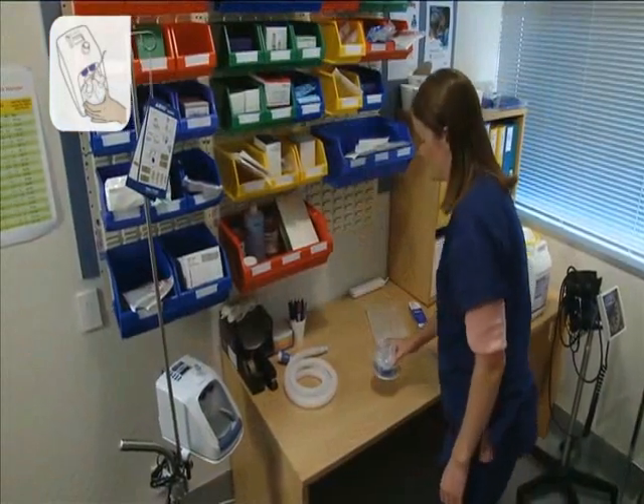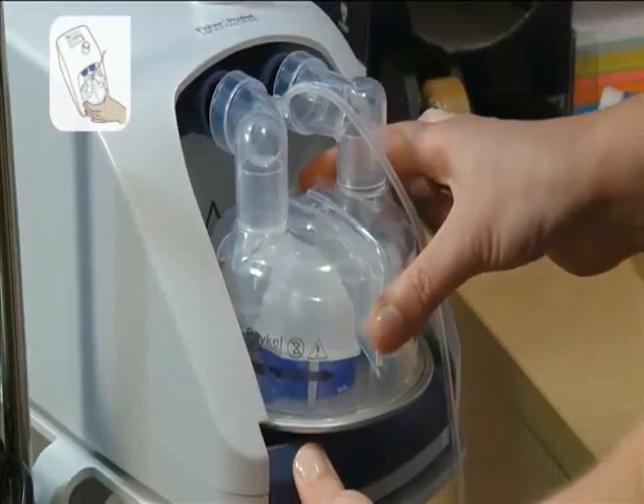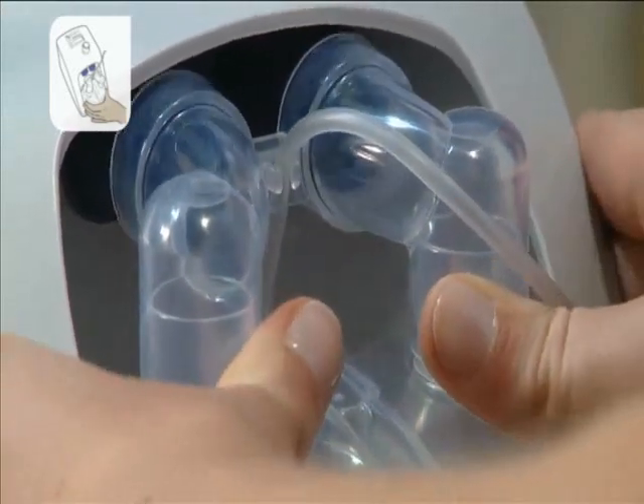Slot the water chamber into the Evo by pushing down the finger guard, lining up the ports, and sliding the chamber into place. Push firmly on the port adapter to make sure the chamber is properly installed.